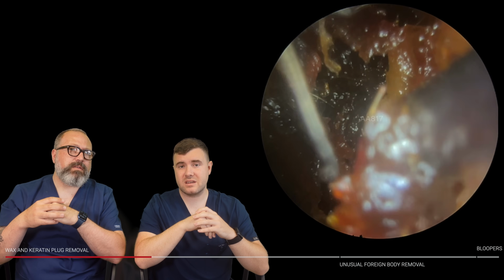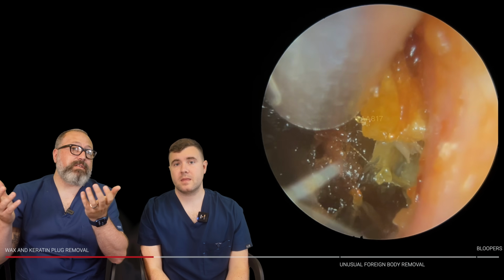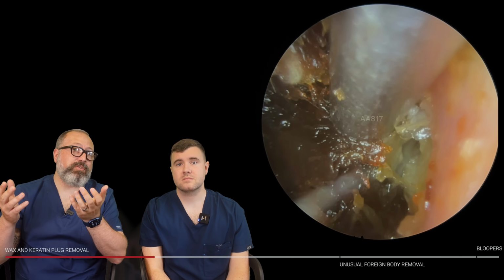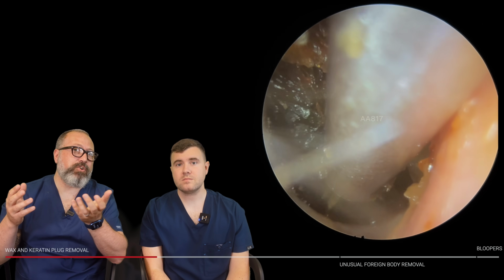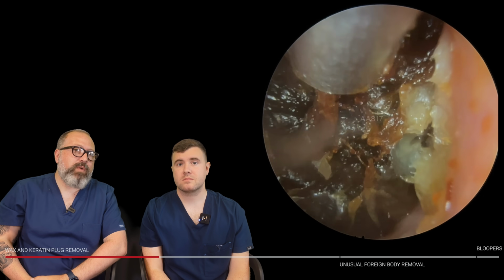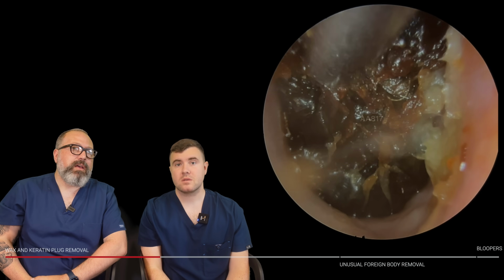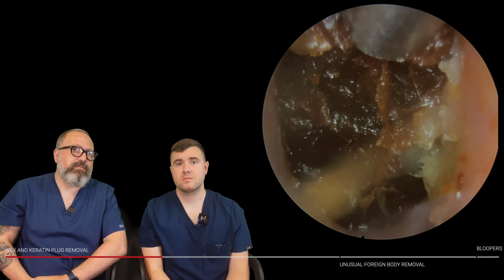Yeah. So it's chipping away, it's coming away slowly. I can't even see the eardrum at the moment, so this patient's been blocked. Goodness knows how long this wax has been building in this patient's ear canal, because this is not an overnight thing. This has been hanging around in there for a long, long time. Even by the colour of the wax, it's much, much darker. Looking at how much keratin there is in there as well, this has been lingering around for a while.